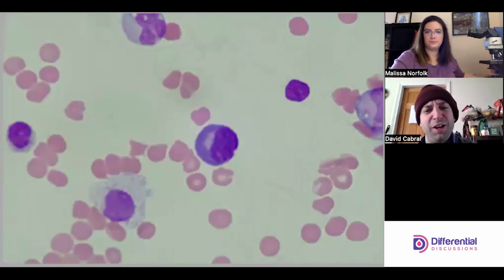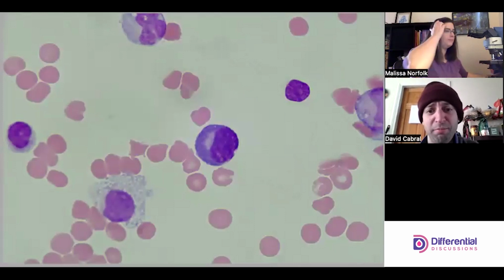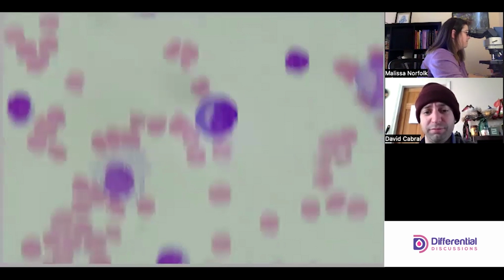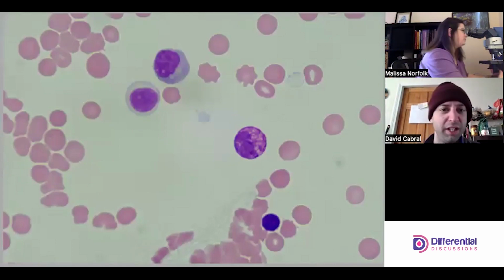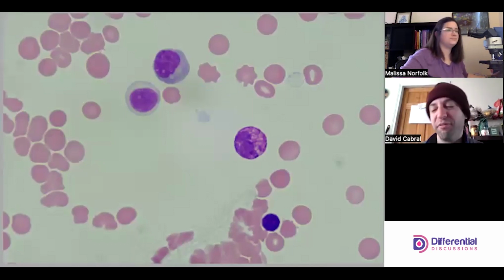Oh, beautiful. So I generally expect the nucleus to be a little bit smaller, but geez, it checks all the boxes that I care about, right? Deeply basophilic, perinuclear halo, eccentric nucleus, plasma cell. He's gorgeous. And look, we've got a baso. Beautiful baso. And maybe another reactive lymph too. A little bit of basophilia, a little bit of a perinuclear halo. I would say that's plasmacytoid and still an active lymph.